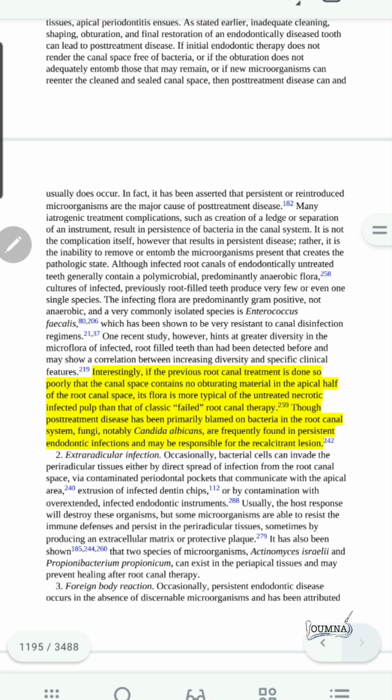First of all, we must know that doing a retreatment of a tooth that is poorly obturated is easier than doing it with a tooth that has been obturated properly, because the bacteria has become more persistent to the treatment when the canal was previously obturated well.